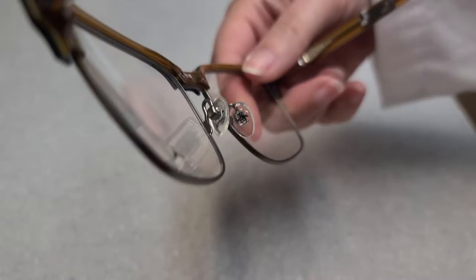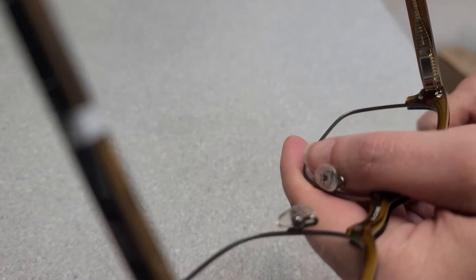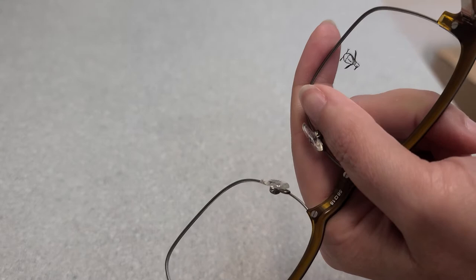So today we will be discussing how to change a set of nose pads on glasses. The most important thing is protecting the lens at all costs. You can see me using my thumb here to protect the lens.